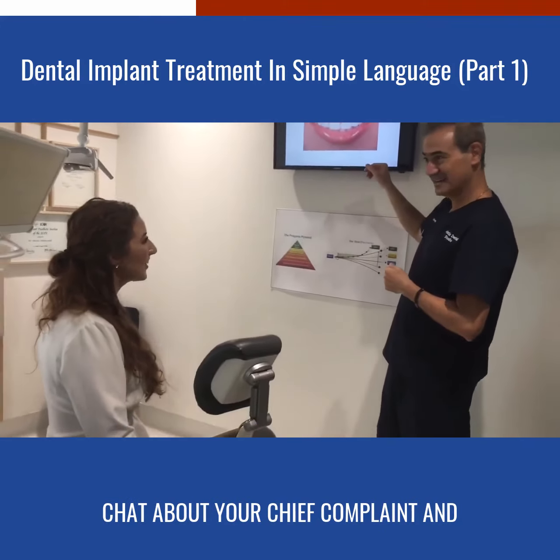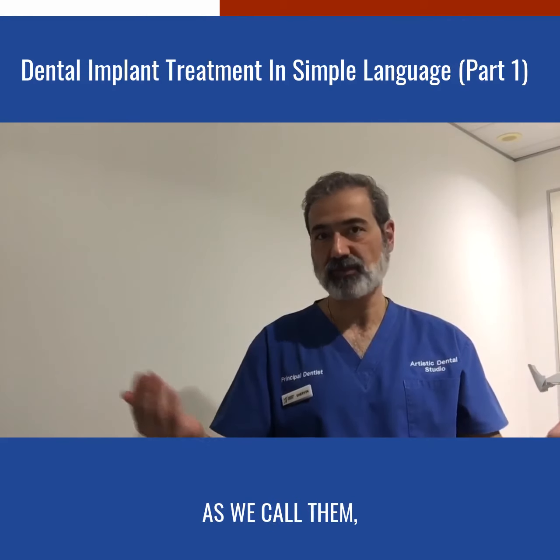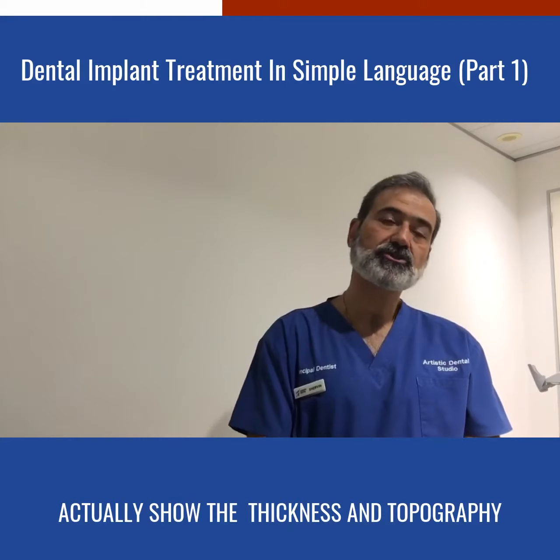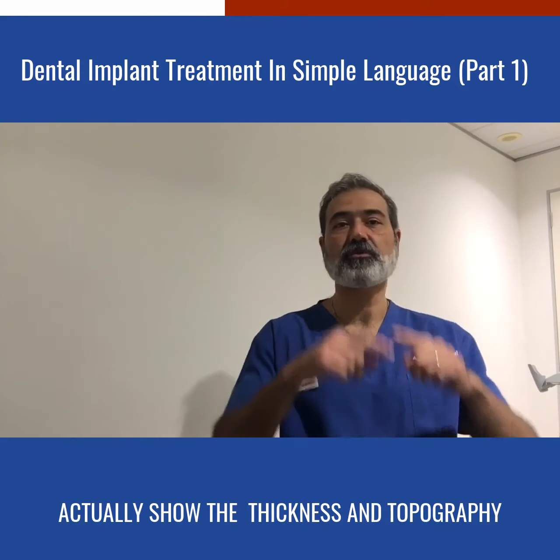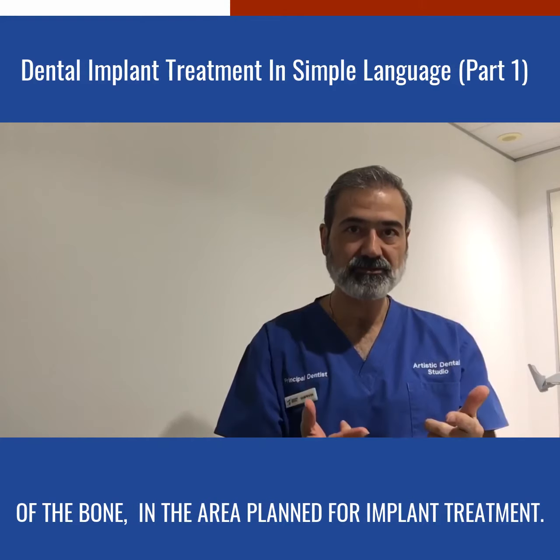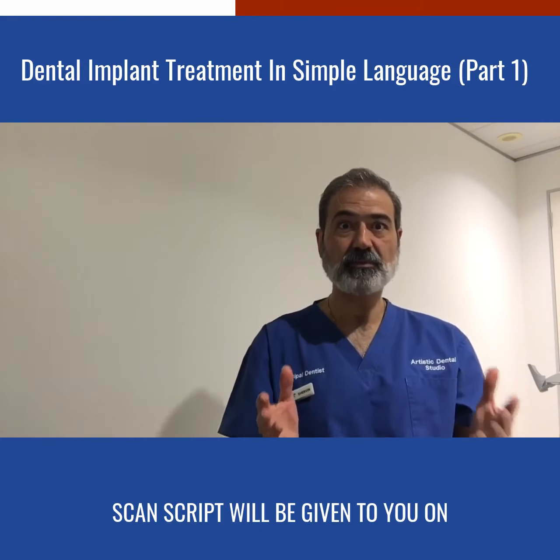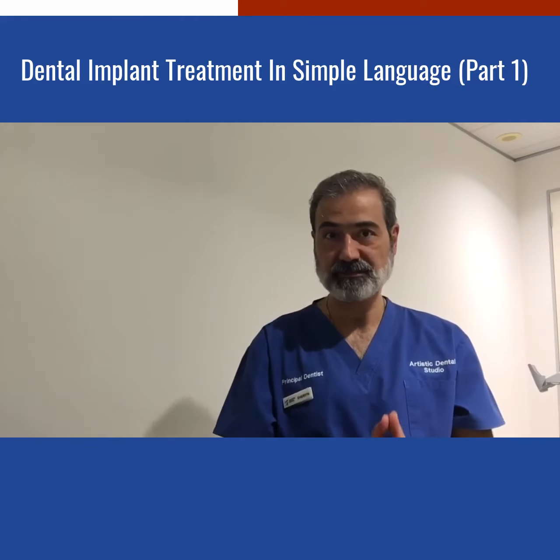They also need to have some scans from your jaws, because scans or cone beam CT scans, or CBCTs as we call them, actually show the thickness and topography of the bone in the area planned for implant treatment. The scan script will be given to you on first session.